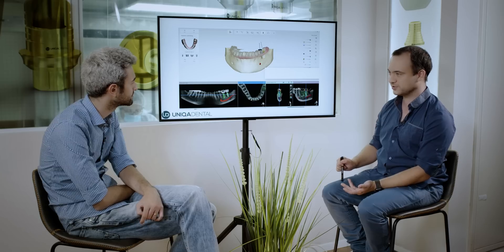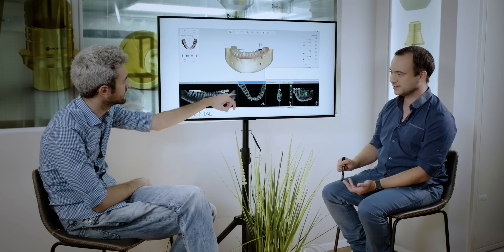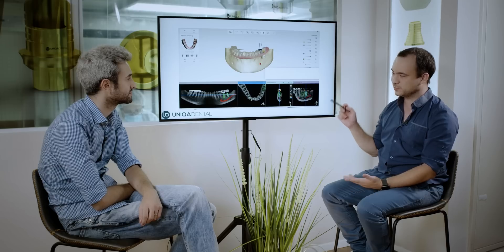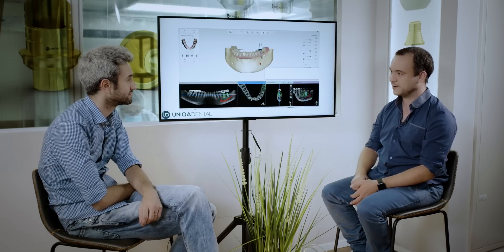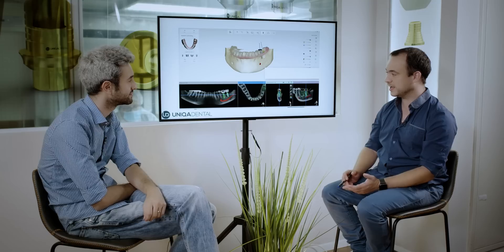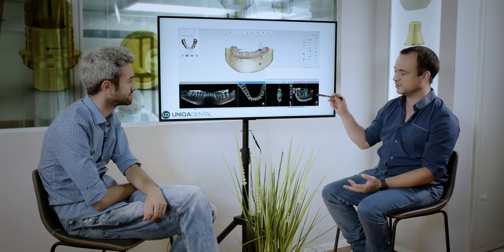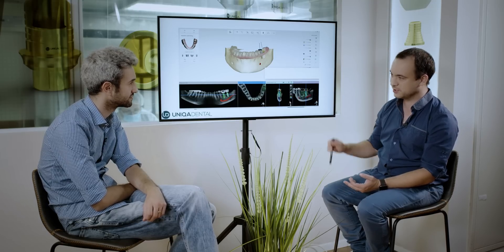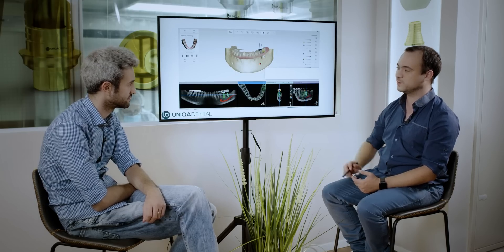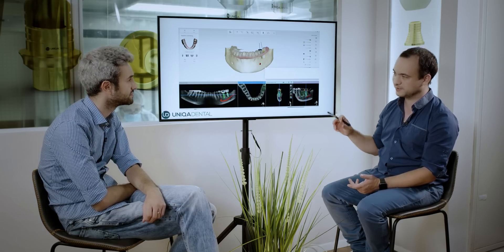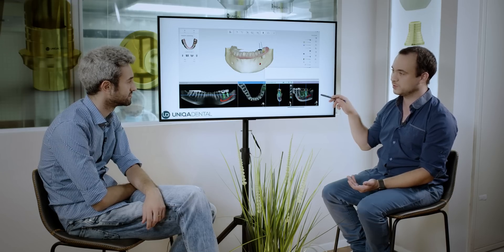I can see even different structures. What are the red lines? The red line is my lowest part of the implant that I can go to. Because in the lower jaw we have a nerve that is responsible for the feeling of the lip and the gum. So if you use too long an implant and you harm the nerve, you can lose feeling in the lip. So this is the lowest part you want — you even want to use a shorter implant to be sure you won't reach the nerve.